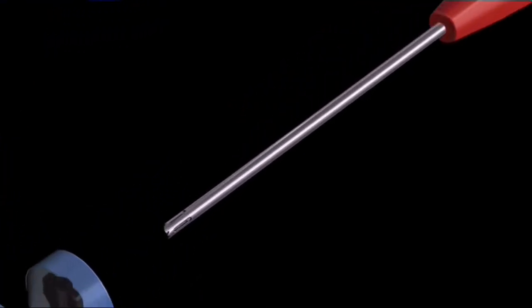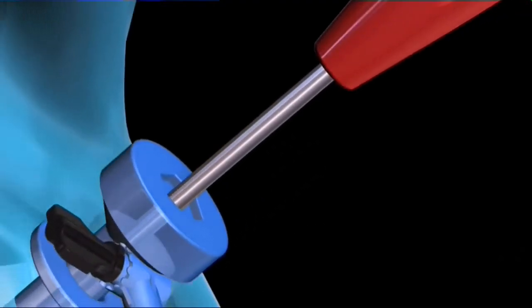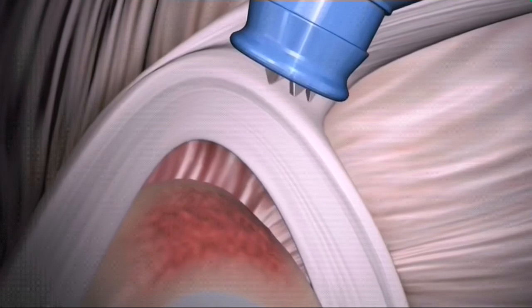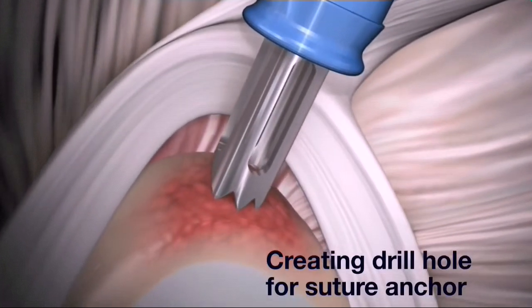Insert the instability drill guide through the anterior superior portal and into the joint. Position the guide superior to the articular cartilage, just under the center point of the biceps attachment.